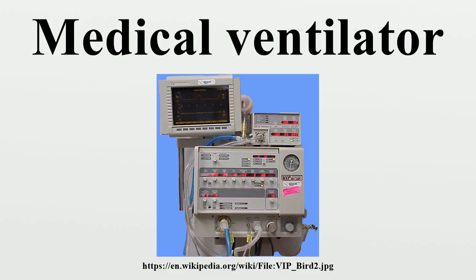Ventilators used under increased pressure require special precautions, and few ventilators can operate under these conditions. In 1979, Seacrest Industries introduced their Model 500A ventilator, which was specifically designed for use with hyperbaric chambers. In 1991, the Servo 300 ventilator series was introduced. The platform of the Servo 300 series enabled treatment of all patient categories, from adult to neonate, with one single ventilator. The Servo 300 series provided a completely new and unique gas delivery system, with rapid flow triggering response.